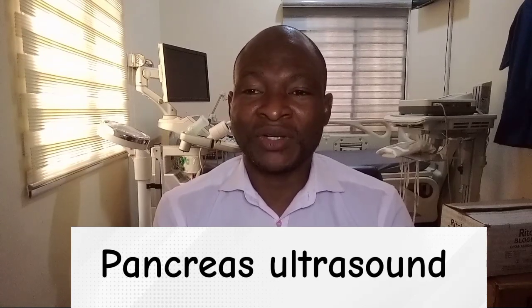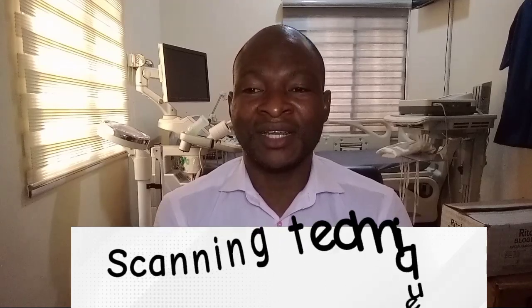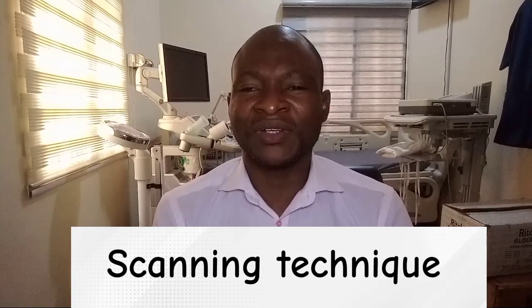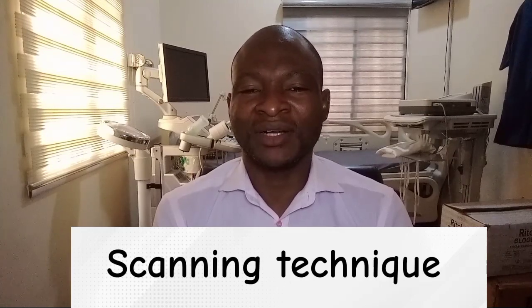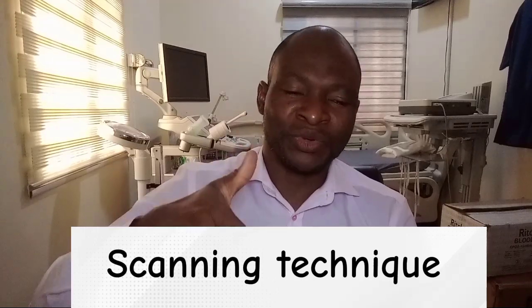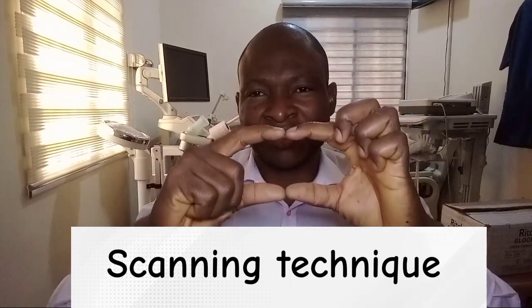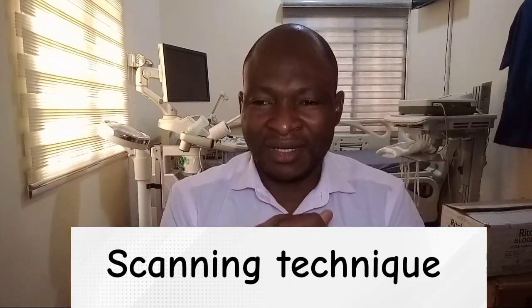So a very simple and quick scanning technique. The pancreas is interrogated in transverse and sagittal sections. To image through the long axis of the pancreas, the transverse section will have to be oblique so that the plane is lower to the right of the patient midline and higher to the left. Yeah, you position your probe in that way because the pancreas is not parallel, it's oblique angled.